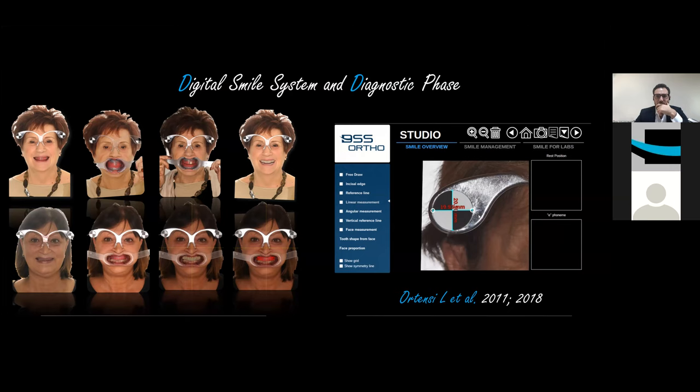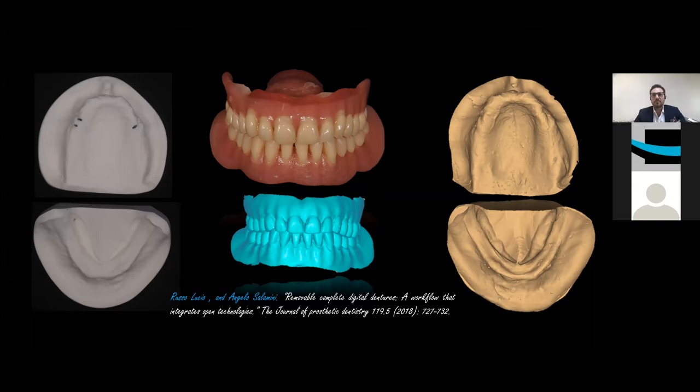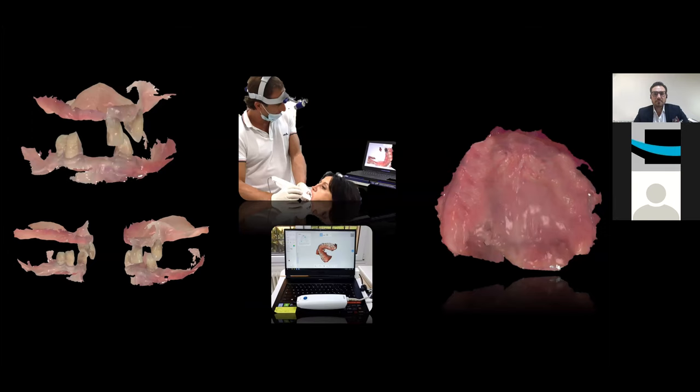And this is some publication from our group. Thank you, all friends. During my third visit, I can take analog impressions, or I can use an intraoral scanner. I can't talk about it in a few minutes, but you have to check on your patient whether your intraoral scanner is the best system to get the right impression, because sometimes you have a difficult anatomy that is so hard to control. So I prefer to use analog impressions, but not always. When I can take a good digital impression, I take a digital impression.